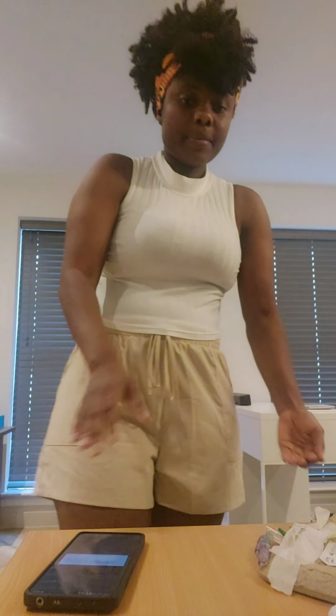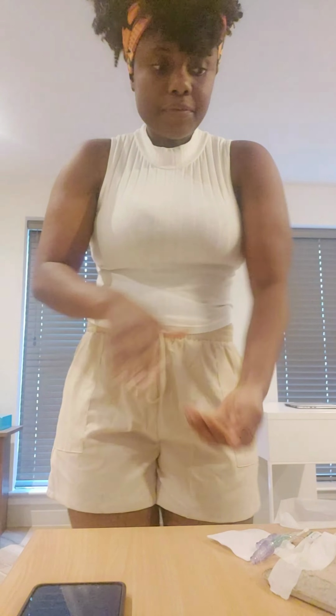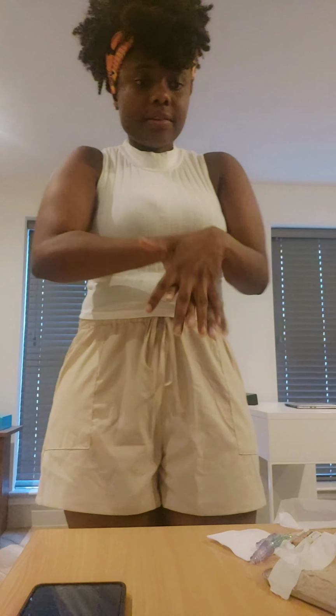Alright, so I'll perform a hand hygiene. I'm going to put on my PPE. Okay, so I'm going to start the IV cannula flush. Okay, so I'm going to perform my hand hygiene according to the WHO standard. And on with my PPE, I'm going to put on my apron.